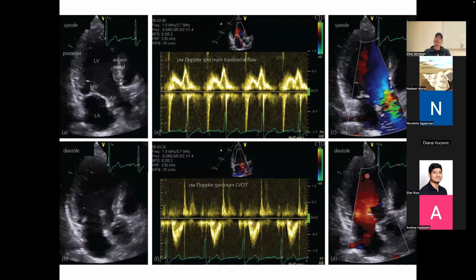You can do this with basically one other imaging technique, which is magnetic resonance. So in MRI, you can make an image that is linearly proportional to the velocity of the voxels at that position. MRI takes longer than echo to do that. It takes multiple heartbeats to do it, as we'll see. Echo can do it in real time.